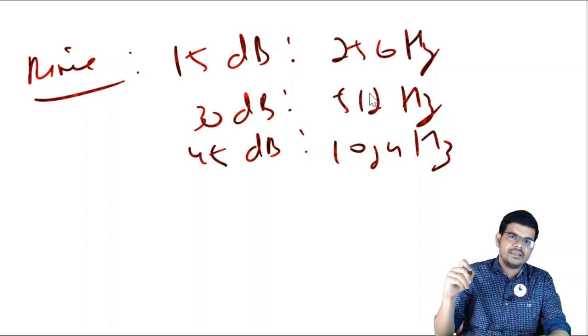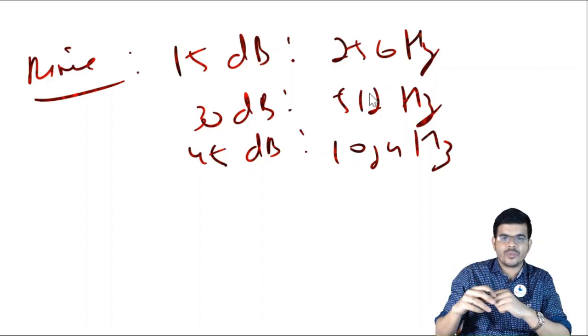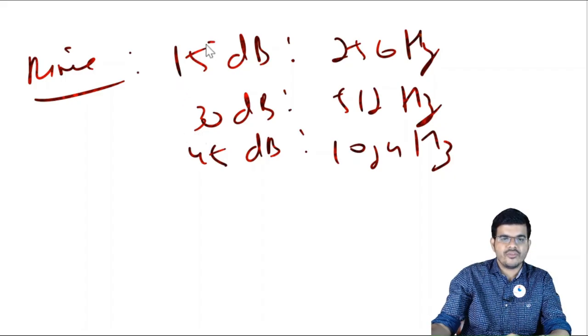So like that, by using the various tuning forks, you can have a rough idea of the hearing loss which are due to a conductive problem. Okay, that is by using the various tuning forks like 256, 512 and the 1024.